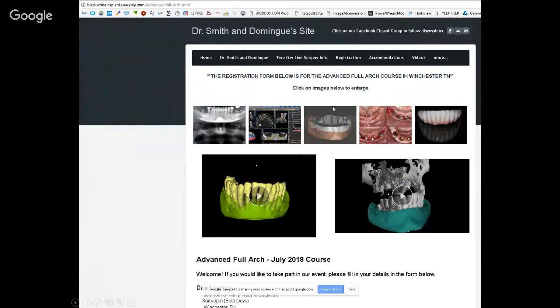This is live today for the Advanced Full Arch course in Winchester, Tennessee. I'll be teaching with Dr. Corey Glenn. We'll be going through the software and Blue Sky BioPlan, showing cases of before and afters, and showing how I get soft tissue, using multi-unit abutments, immediate loading, full arch fixed cases, and getting the results that I'm very pleased with and pleased to show.